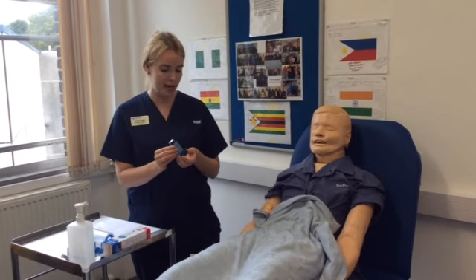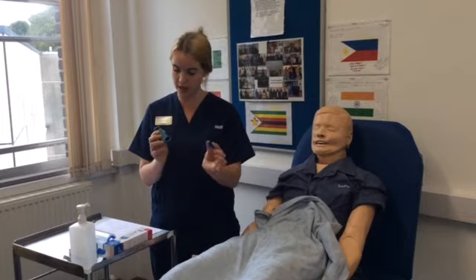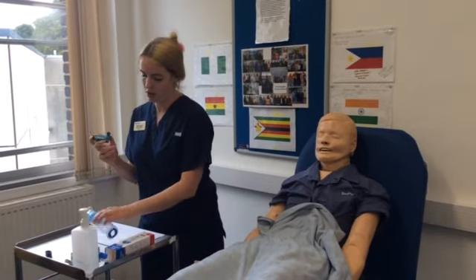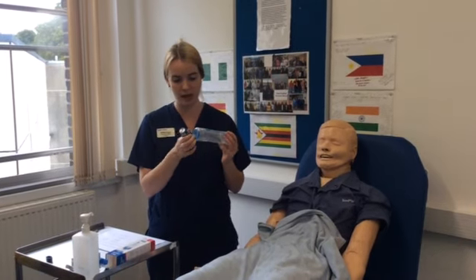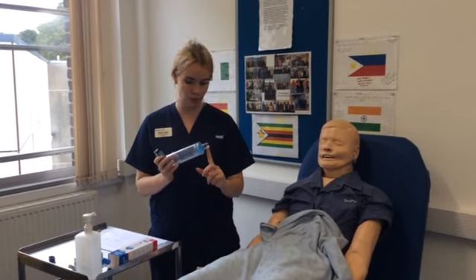So this is your inhaler. It's called salbutamol. What you need to do first is you need to remove this cap, and then you need to shake it for 2 to 5 seconds. Then you have this, which is called the space chamber. You need to insert the inhaler into this side at the back. This side is where you put your lips to breathe.